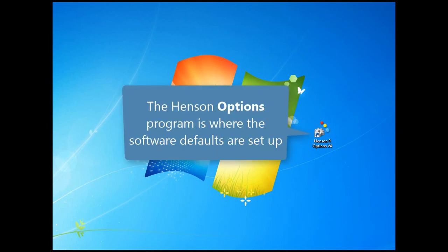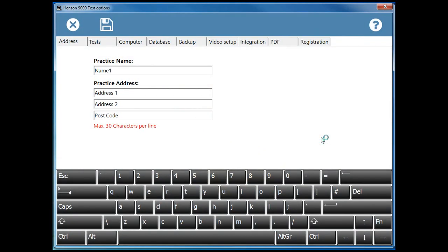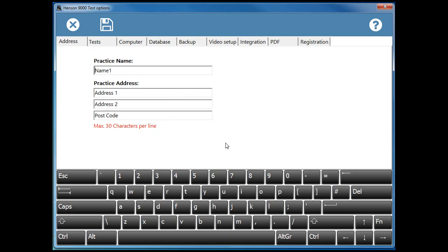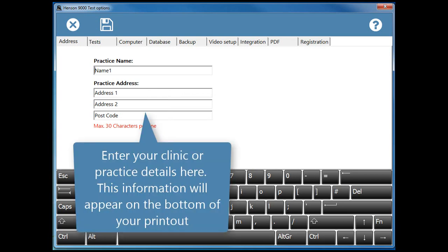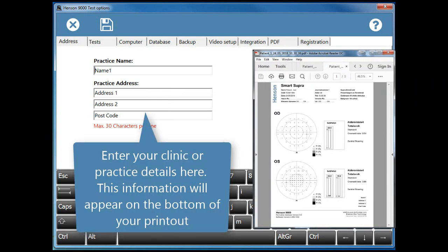The Henson options program is where the software defaults are set up. If your software is not licensed yet, the Registration tab will be shown as the first page. Enter your clinic or practice details here. This information will appear on the bottom of your printout.